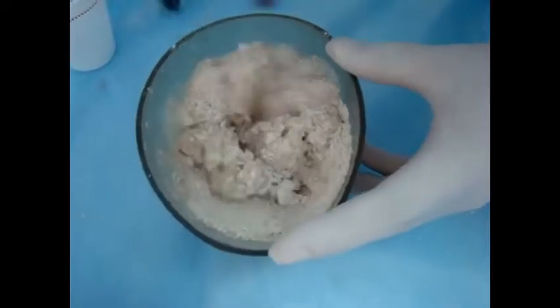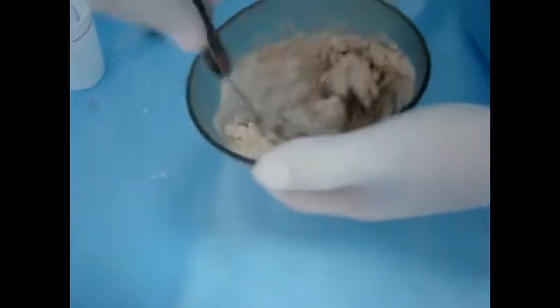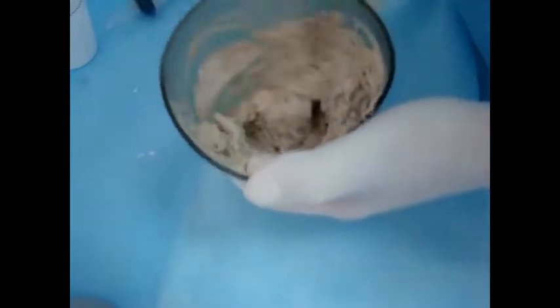Always stick to the measurements. We start mixing all the powder particles with water.